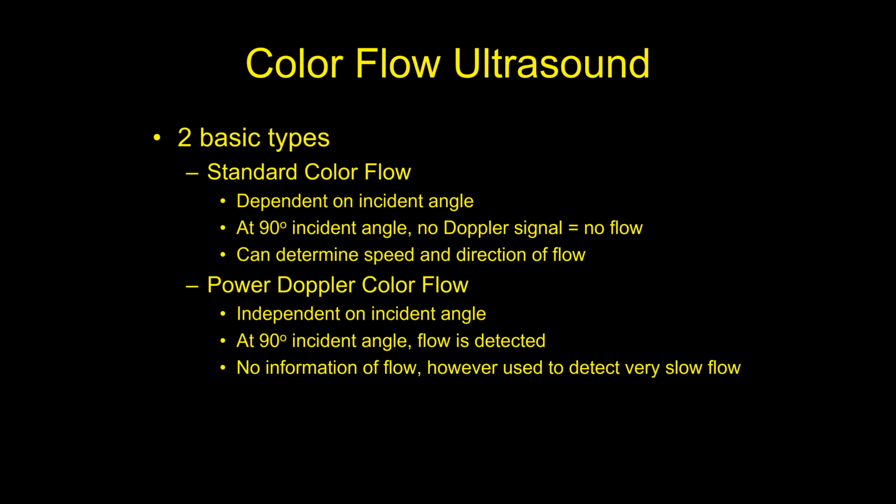Okay, so we left off. We're going to talk about color flow ultrasound. This takes advantage of what we just learned about sound interacting with matter and the Doppler effect. And this is visually how you can get information when you ultrasound a blood vessel, by looking at what color that blood vessel is going to show up with on the machine.